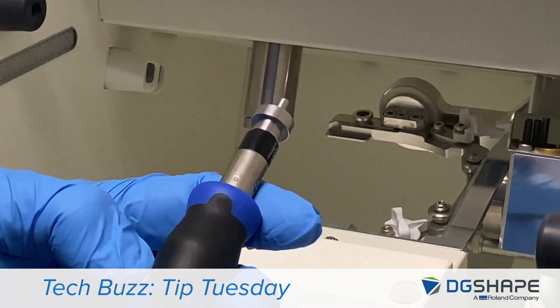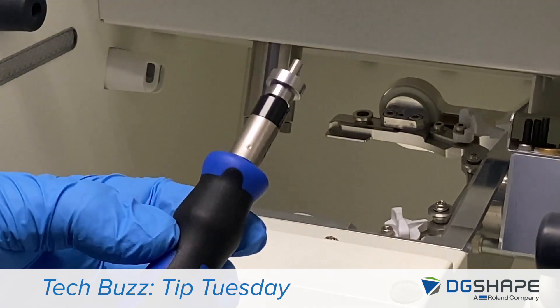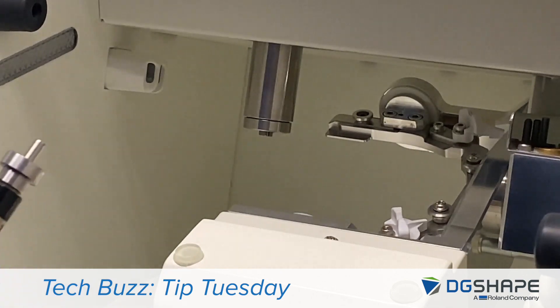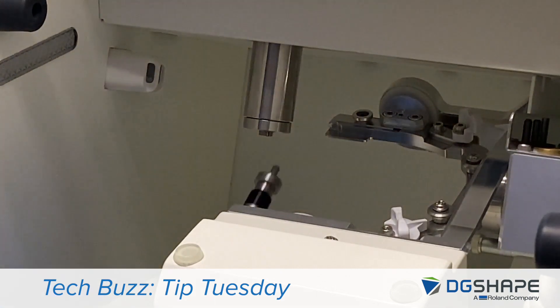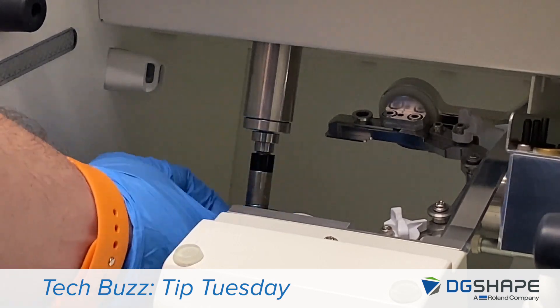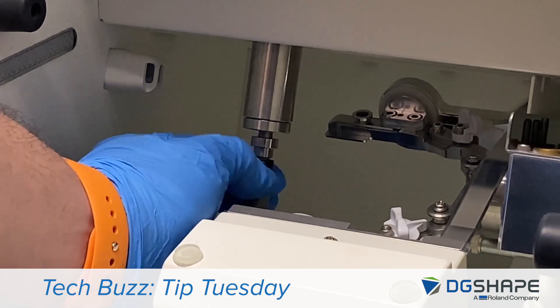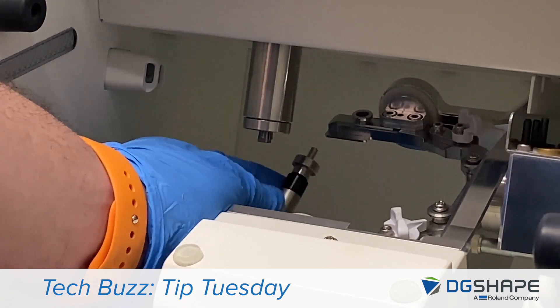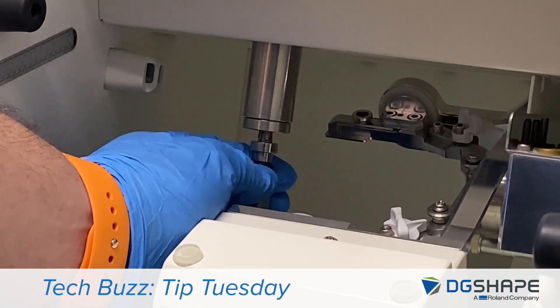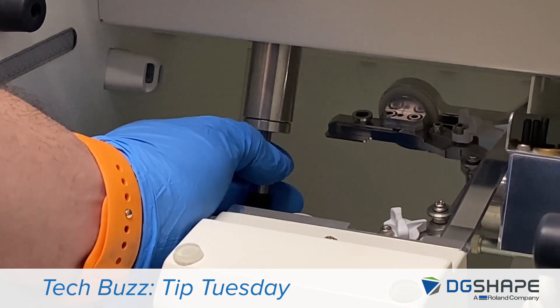This machine is a newer model, so we're going to use this tool. All you're going to do is come in here, get up under the collet, engage with it, and pull it out — pretty straightforward. A little tip if you do have an older machine: it's very, very important to support the inside of the collet as you're removing it so that you can avoid breaking it or damaging it.